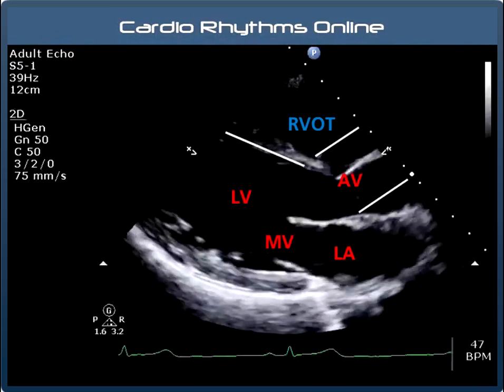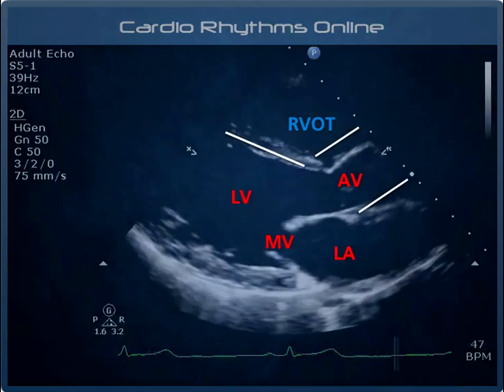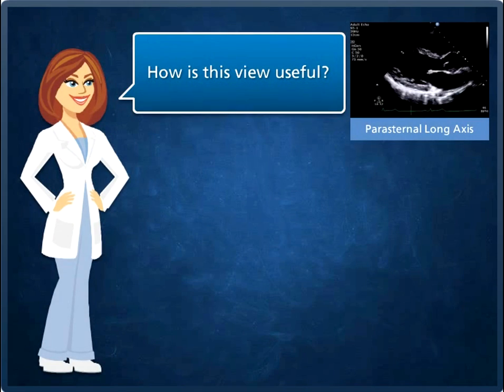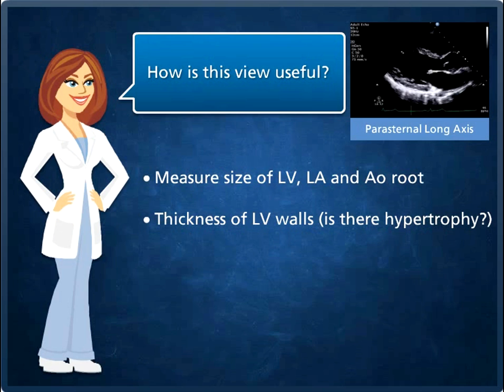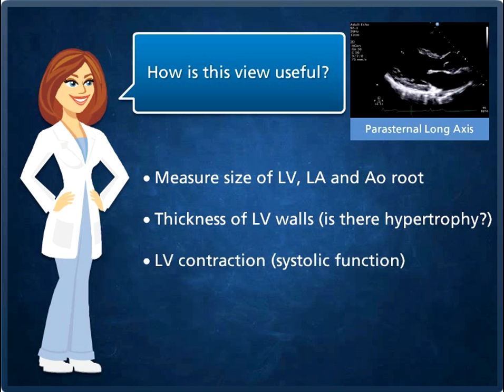Here we can also see the aortic root. We mainly use the parasternal view to measure the size of the left ventricle, left atrium and aortic root, and to measure the thickness of the left ventricular walls, checking for abnormalities such as hypertrophy. Although we can't see all the segments of the left ventricle at this point, we will also form an impression of how well the left ventricle is contracting. We then take our first look at the aortic and mitral valves.